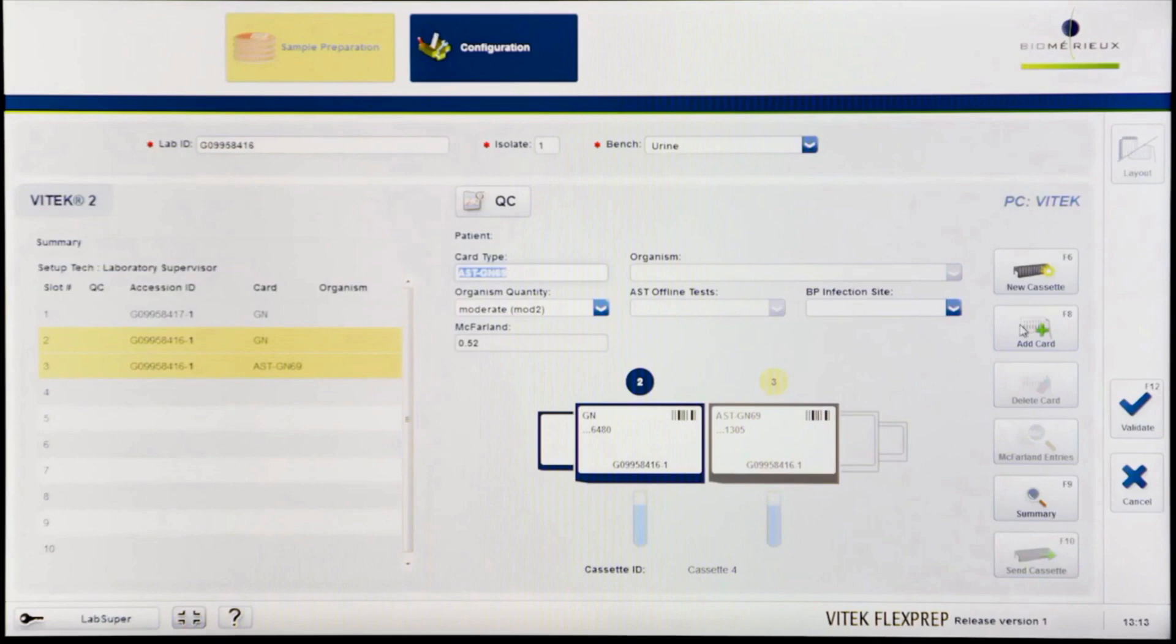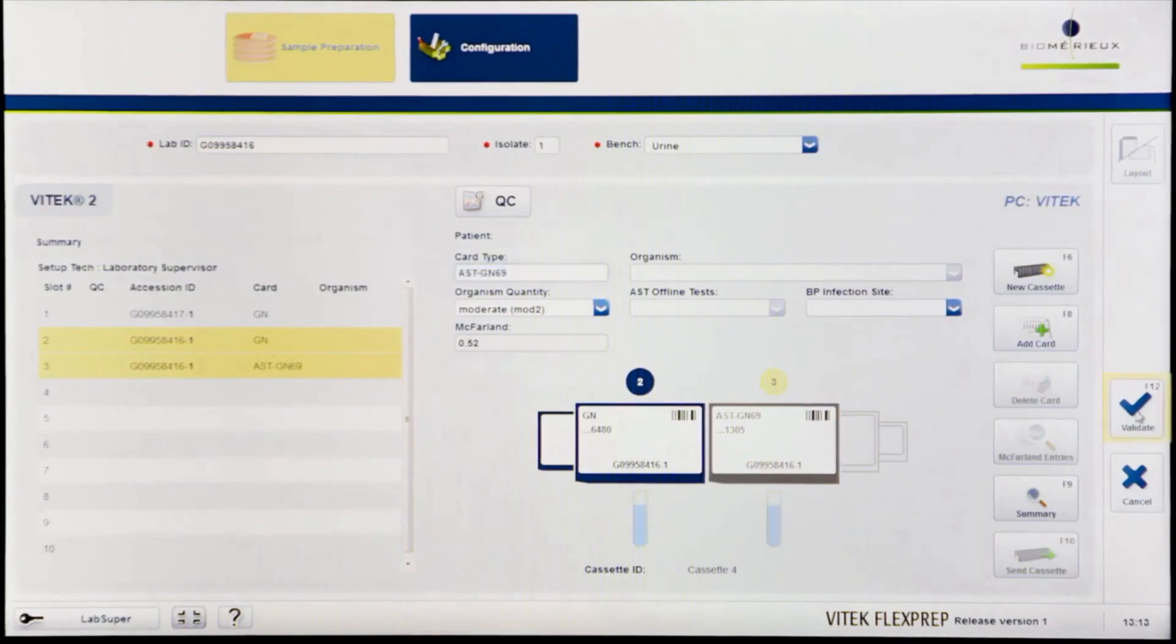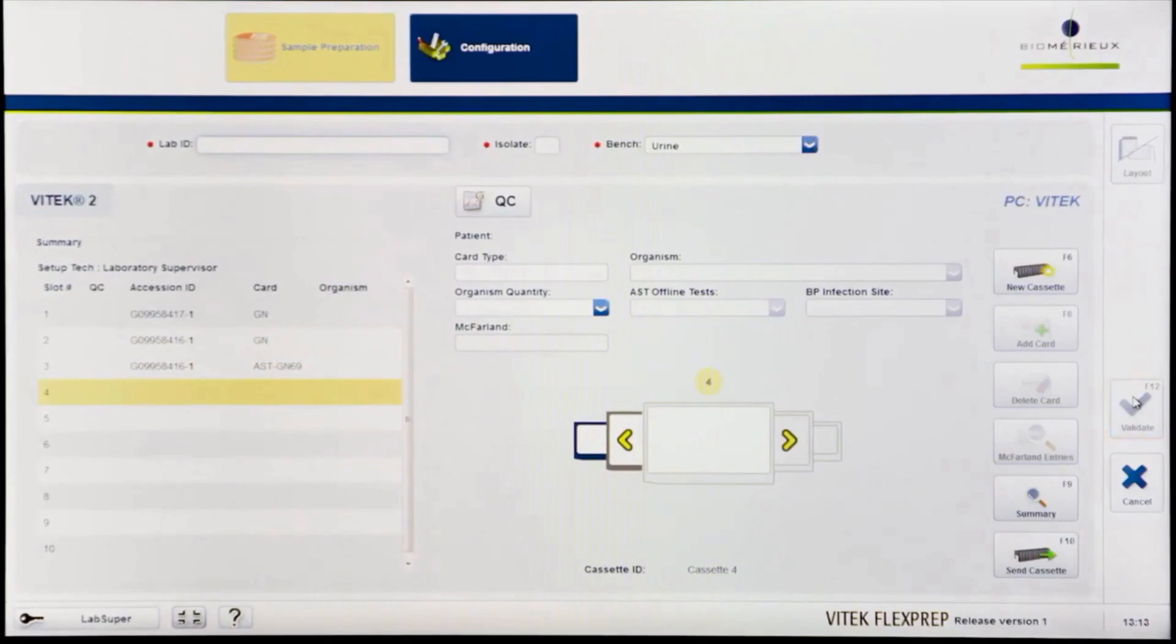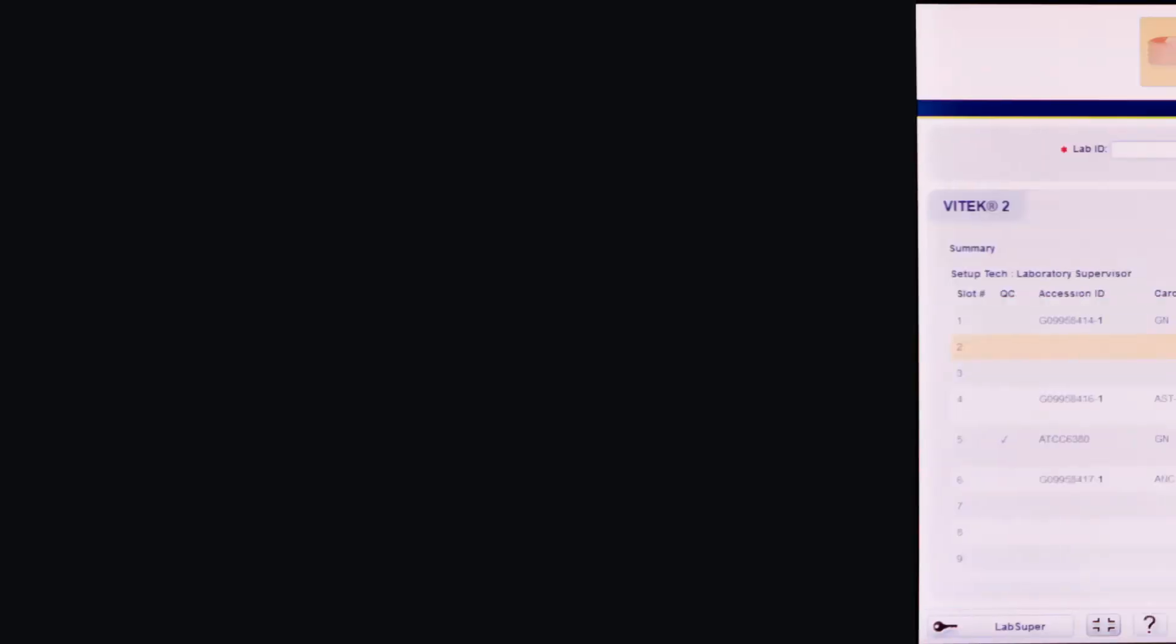Confirm all details for the isolate are correct and then click Validate or press F12 to save the information and advance to the next slot to begin setting up cards for the next isolate.